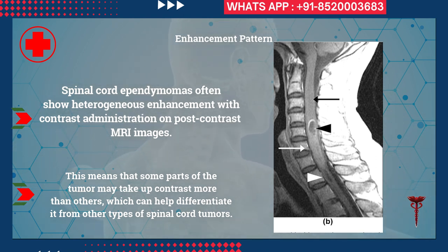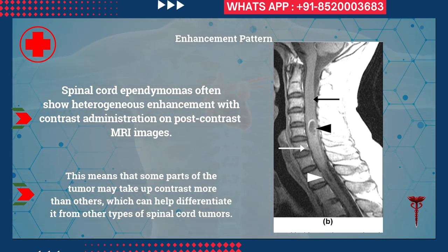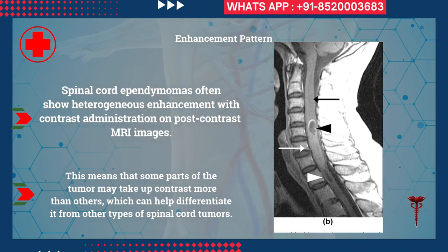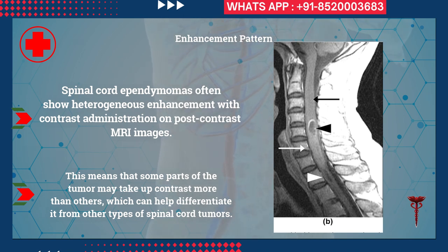As you can see in this picture, some parts of the tumor are non-enhancing while other parts are enhancing, demonstrating the characteristic heterogeneous enhancement pattern of the tumor.